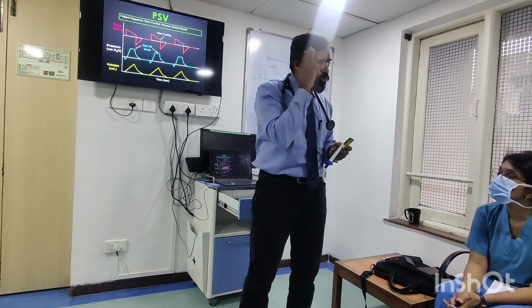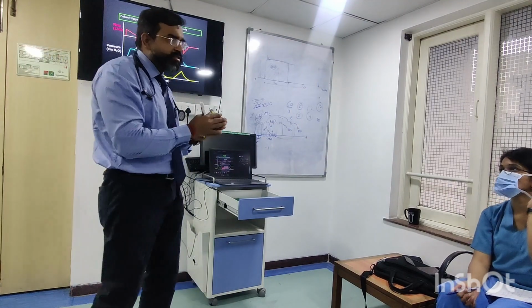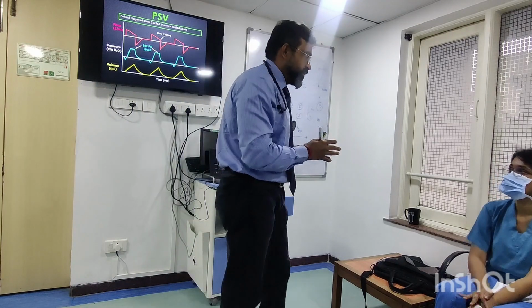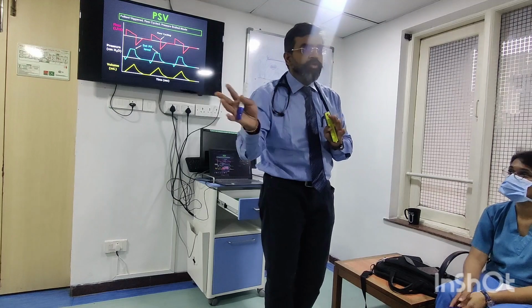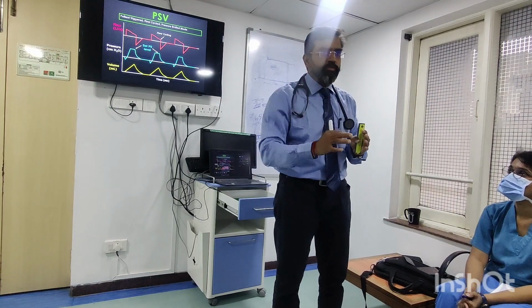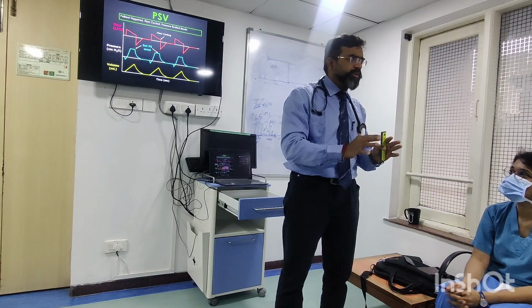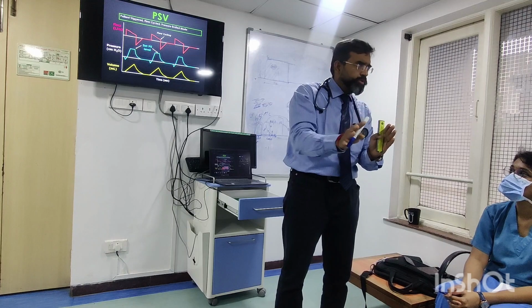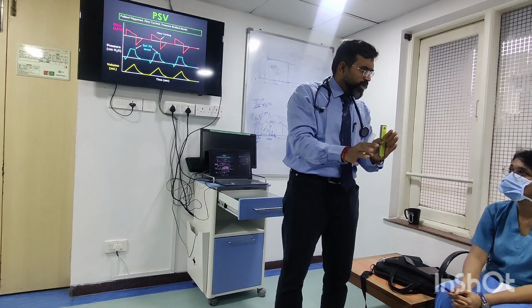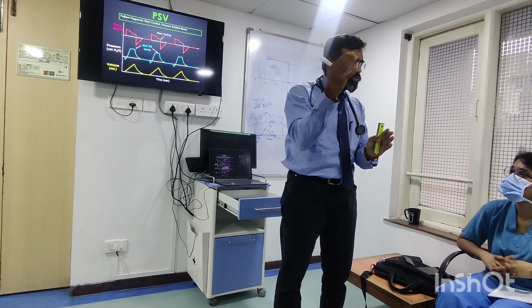So remember, don't confuse those names with these things. Understand the breath delivery and talk the same language. So in the ICU, one person should not say "I'm putting ASB" and another say "I'm putting pressure support." Everybody says the delivery of the mode as trigger, limit, cycle. We use the same terminology. If you are using pressure support, irrespective of ASB, you say pressure support. You understand? Colloquially, don't use the machine terminologies.